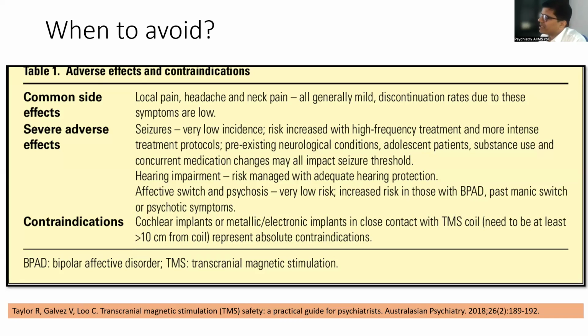having a history of seizure in the past, those who are taking some medications which have a pro-convulsive effect, like clozapine, clomipramine or tricyclic antidepressants in a high dose, or those patients who are receiving rTMS with a high frequency protocol. High frequency protocol has a tendency to cause seizure-like activities in some patients, or those patients who have a significant sleep impairment that can reduce the seizure threshold and increase the risk of seizure. In those individuals, you need to be very cautious.